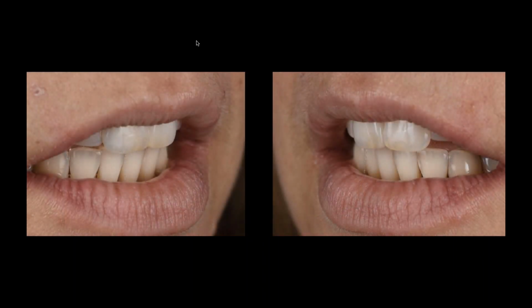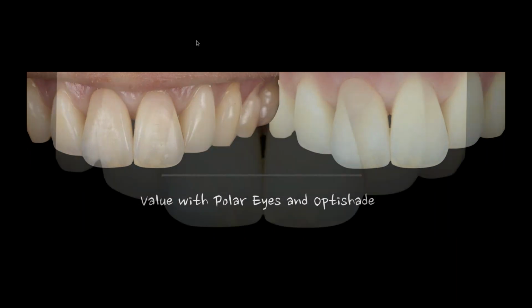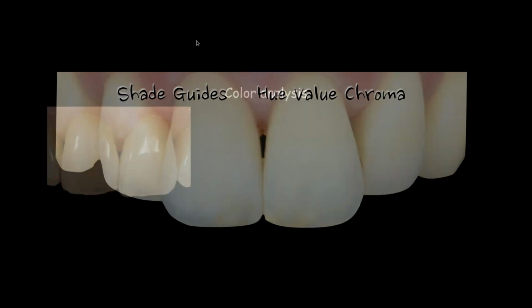And by the way, without the photography after, how do I ever learn? How do I get better? How do I improve what I do? And how do I make choices that will make the next scenario better for me to use? So along the way, each of these processes, whether it's from the clinical side, the laboratory side, or just understanding the patient side, becomes really critical for me to understand each aspect of the communication process.